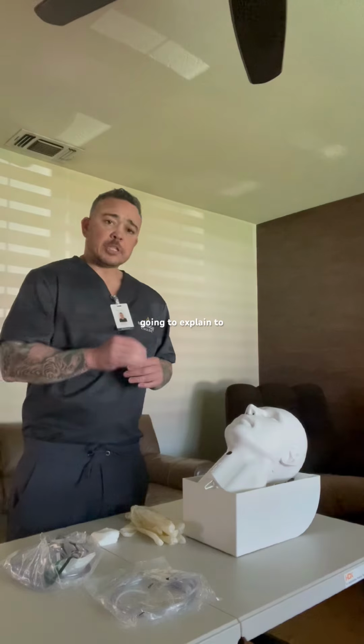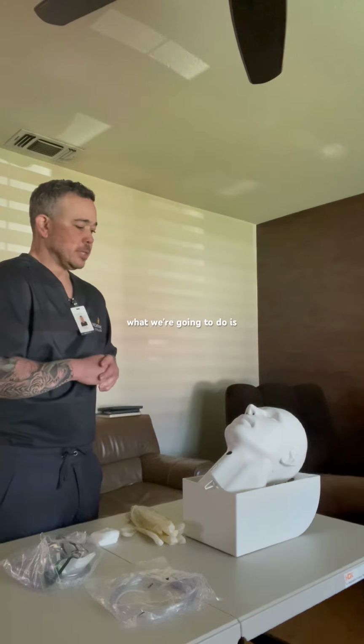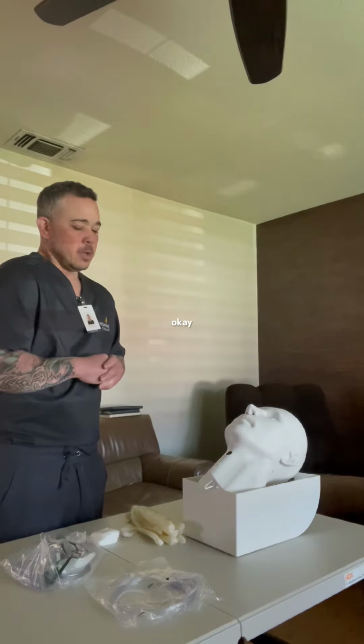The next thing I'm gonna do is explain to the patient what we're going to do next. Okay, Mr. Smith, we're gonna go ahead and do an oxygen therapy. Your doctor has ordered some oxygen for you. Apparently your oxygen levels are a little low. So what we're gonna do is apply a nasal cannula and begin the oxygen, okay?